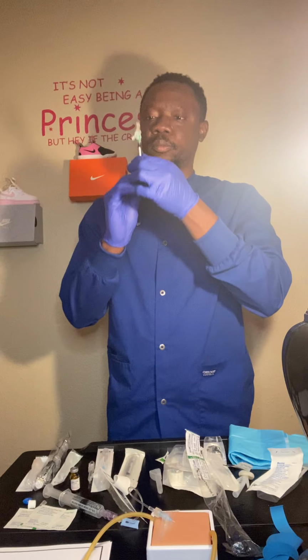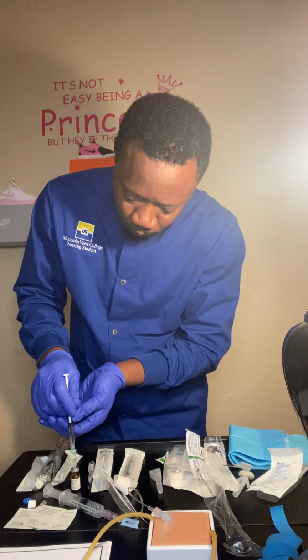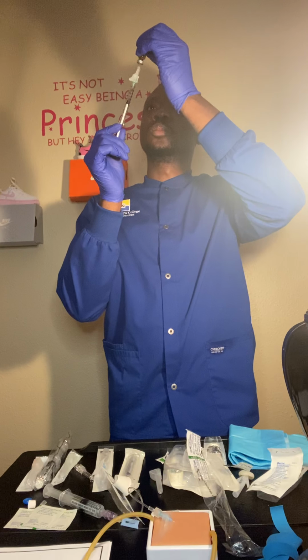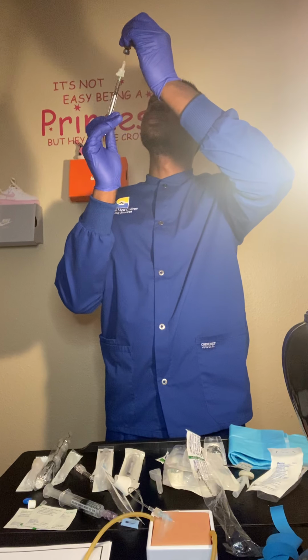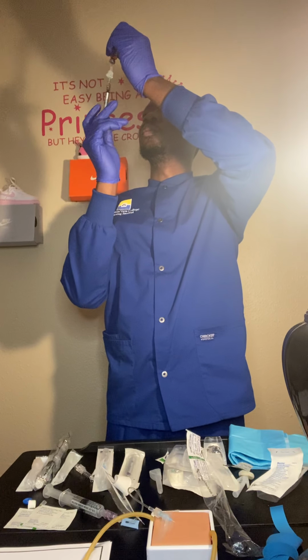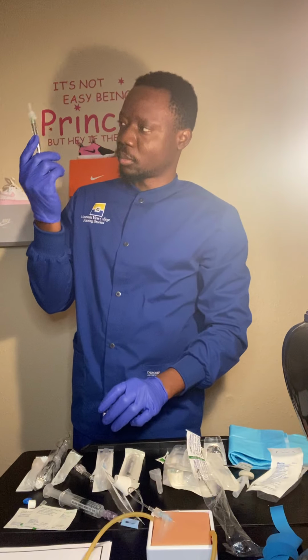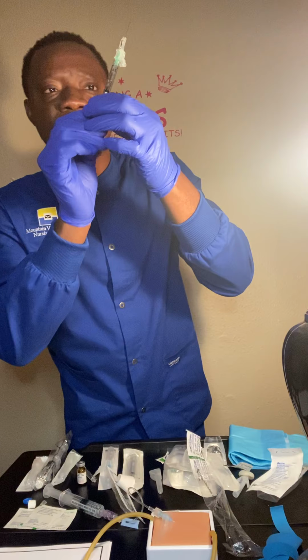Dose 0.5 air. So I got my 0.5. You guys see my 0.5?